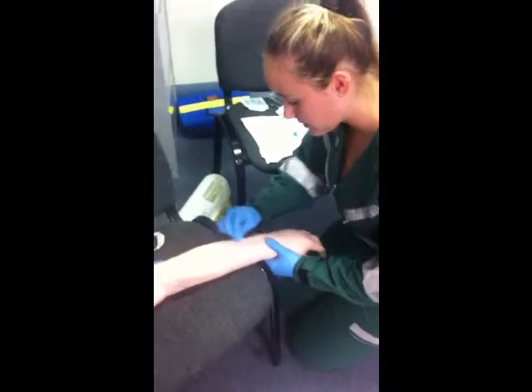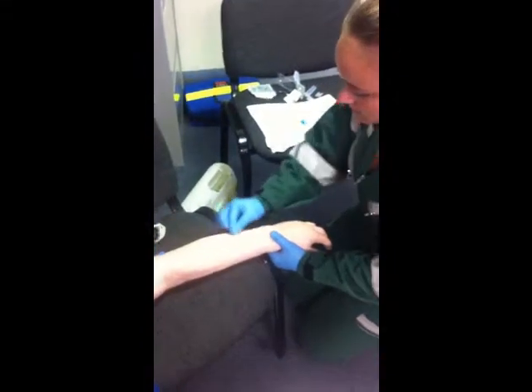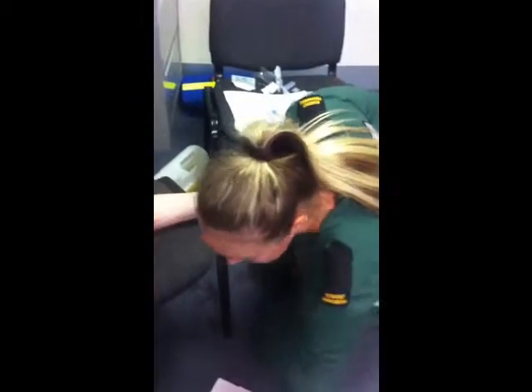I just want to see what my hands are doing. If you don't get a flush, it doesn't matter that much. Just get used to the process. All right, I'm good to go.